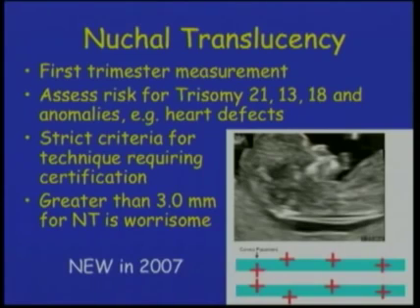And in this diagram, you can see that the fetus occupies about 75% of the image from the chest up to the head, that we can see the amnion separate from the chorion, and that when we measure it, we need to be very accurate on exactly where we put the cursors, as this is the correct placement.